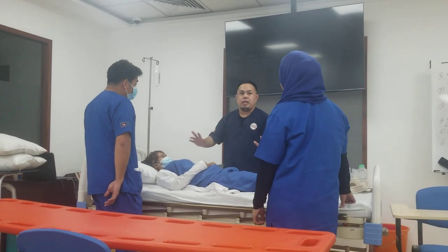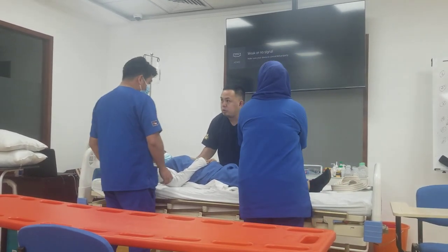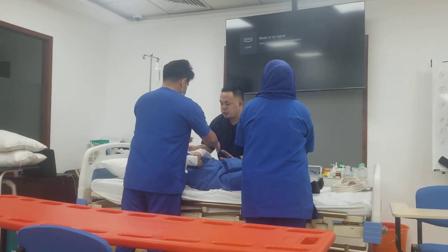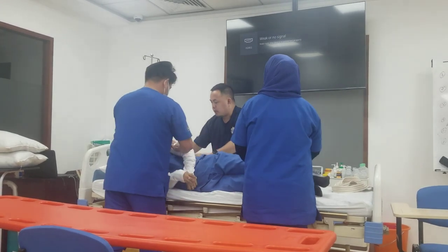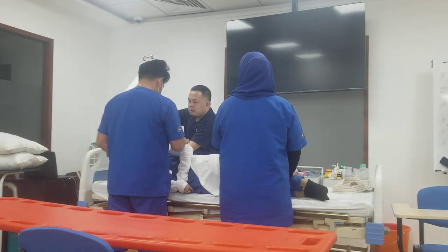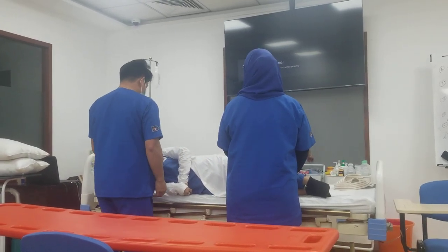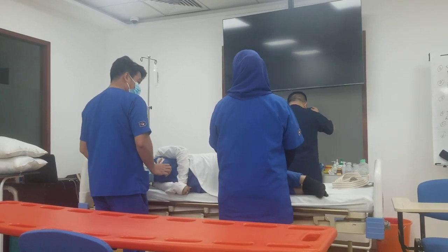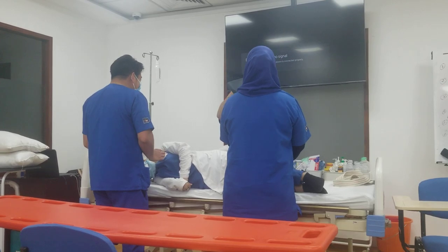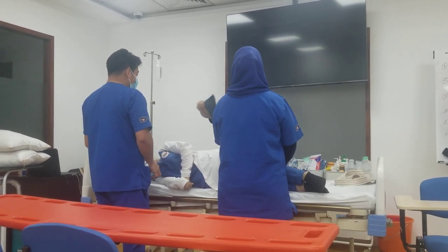Ask your colleagues to help you hold the patient and turn the patient towards you. Remove the pillow and put it to the side. Then grab the slide sheet and spread it on the side.